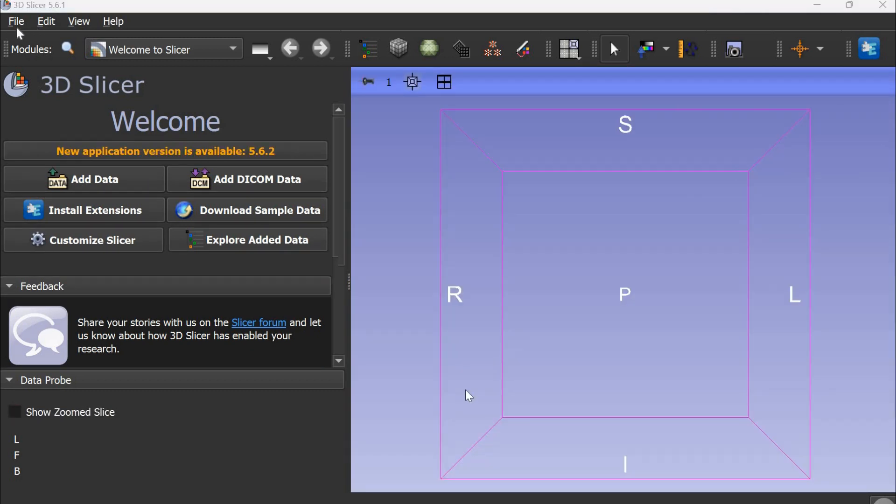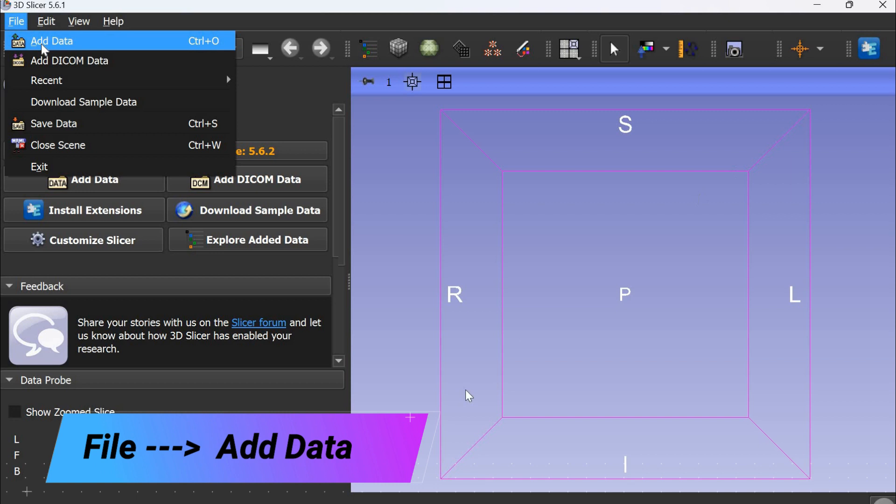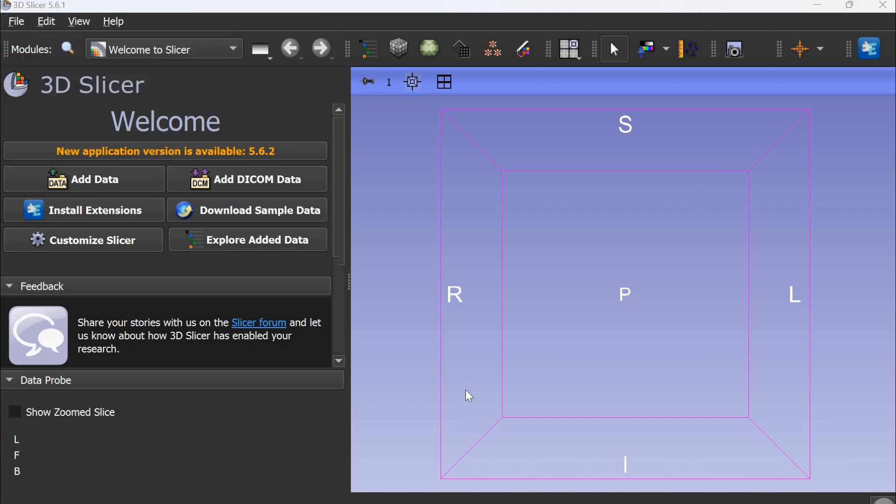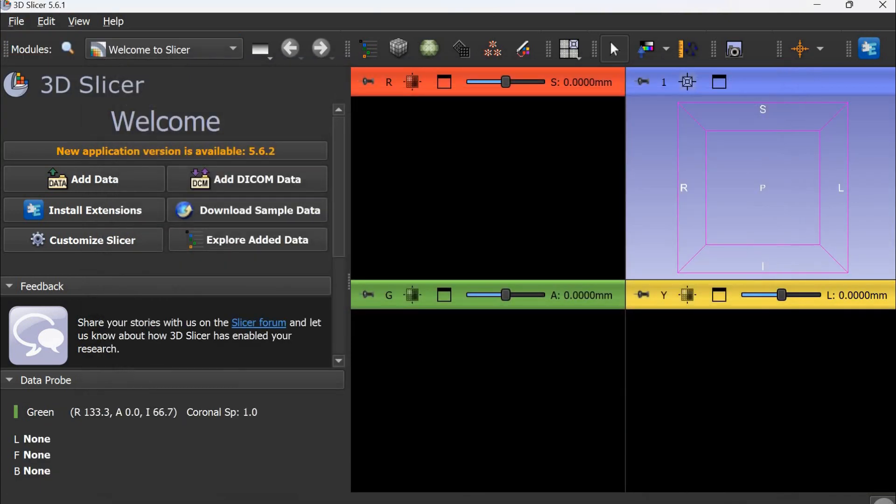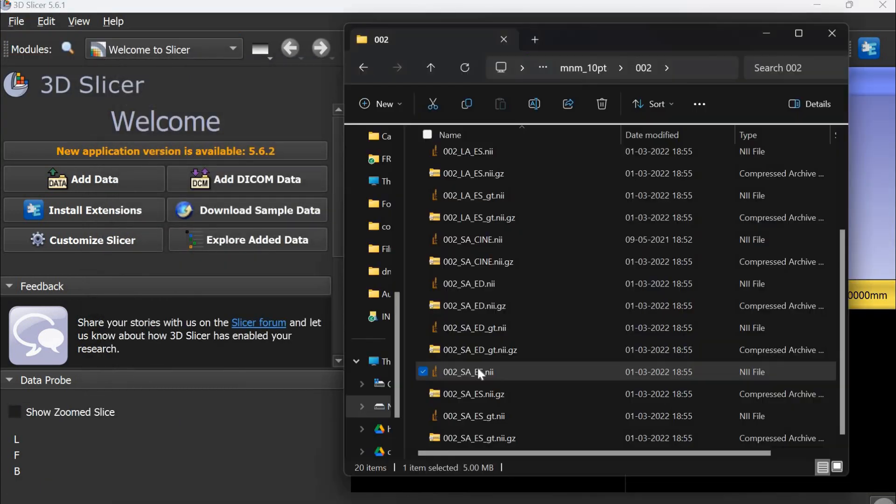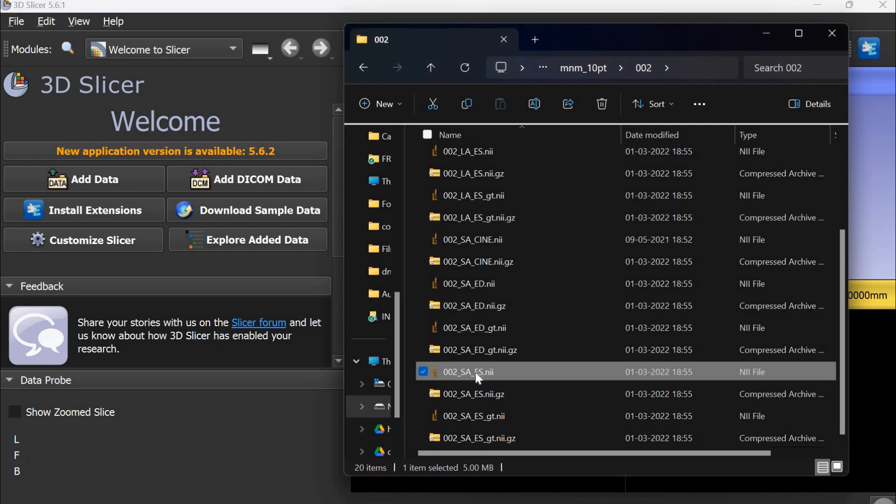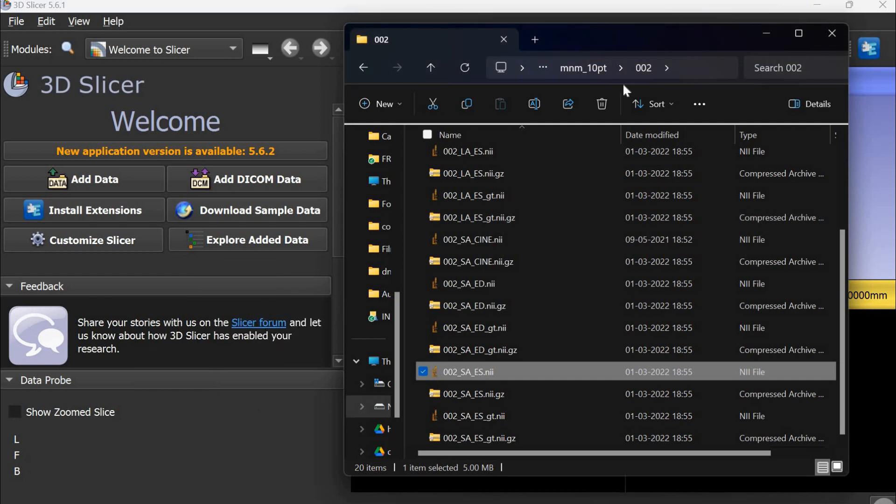To load data on Slicer, you can go to File, Load, and then choose the file or folder. Or you can directly drag and drop the files inside the software.